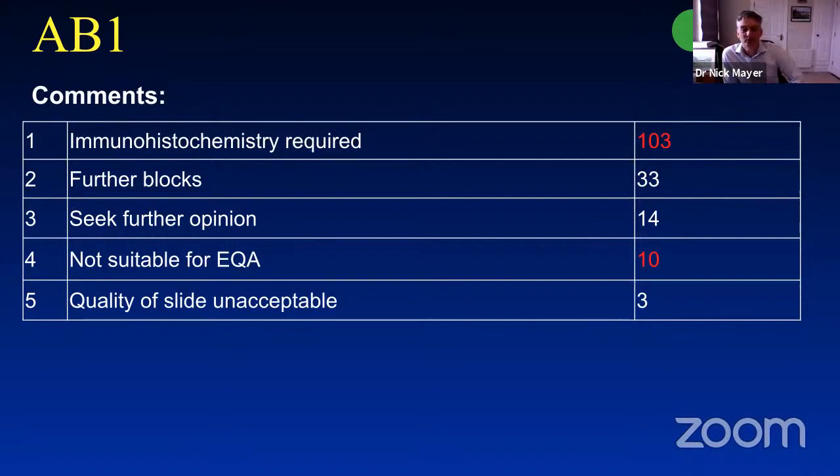These are the comments that we got. A lot of people, over 100, were requesting immuno. We weren't given any with this case, which is something to bear in mind when we go on to scoring. 10 people said not suitable for EQA, and there were a few other comments there.